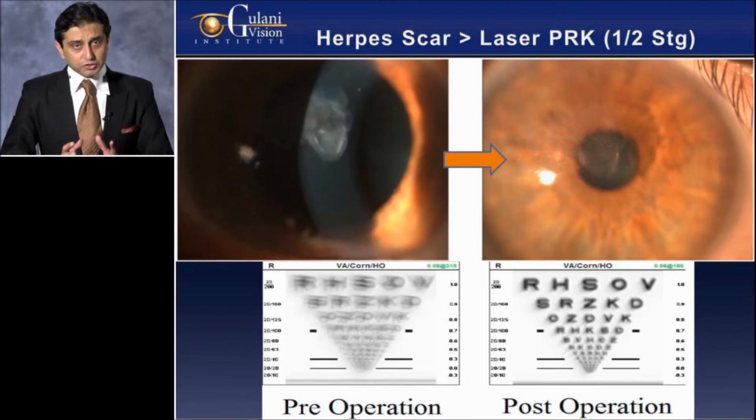Now, with this patient, I basically went ahead and did a myopic ablation laser, again with principles of corneoplastique, and you can still see the scar post-op, residual. But the beauty is, why was this patient happy? So coming from a vision of 20/400 best corrected to 20/50 uncorrected, despite that scar with excavation, following just a minor laser PRK technique, this patient is thrilled because you can see the OPD down right there, pre-op and post-op.